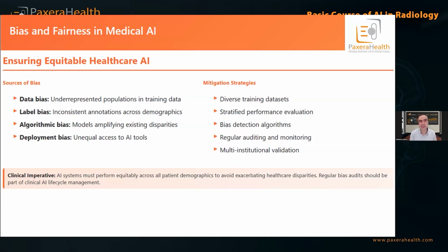That can be an issue if the algorithm used to generate the GAN images is not right, or if they are fake images that are not clinically right, which can produce a problem. So these are a few things we need to consider when developing or testing an algorithm.